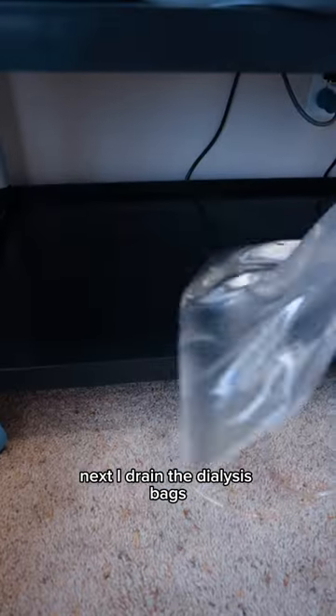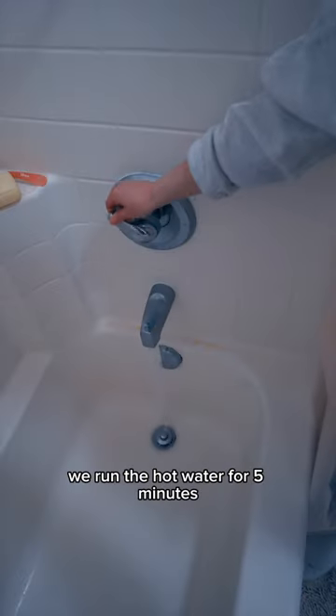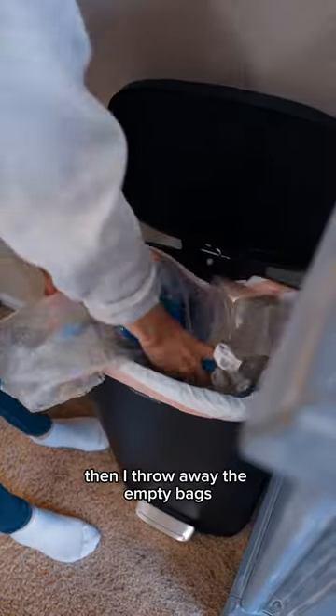Next, I drain the dialysis bags, but first I have to get a sample of his fluid for labs. Once I drain them, we run the hot water for five minutes. Then I throw away the empty bags.